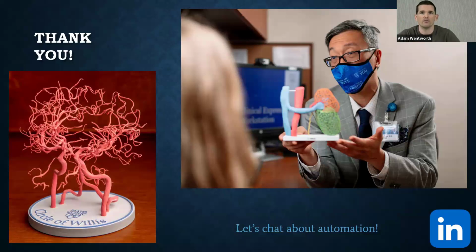Say a model had internal cavities that weren't filled, that yields additional surface area, that throws that calculation outside a standard deviation value, and that gets brought to the user's attention by pausing at that point and asking the user what they want to do about that part. So there are clever things that you can do within scripts to also check QA. Yeah, interesting. So automated sanity checks and other quality checks that you can bake in.